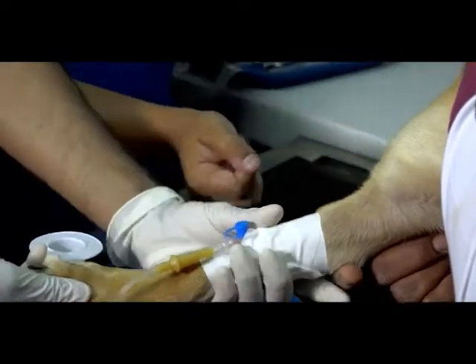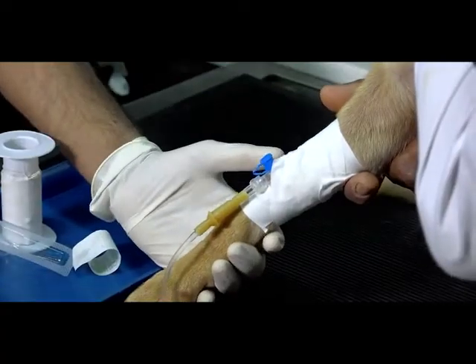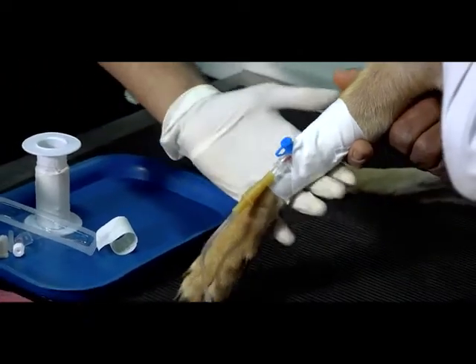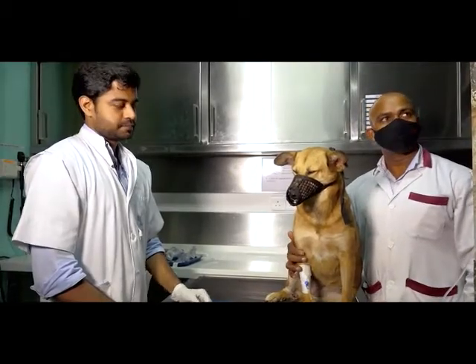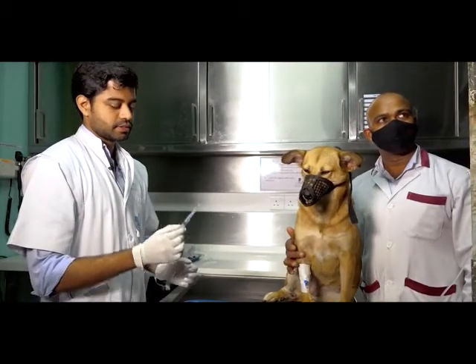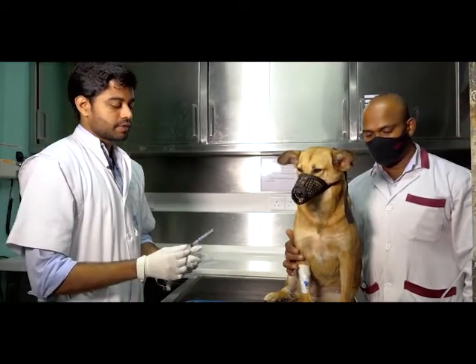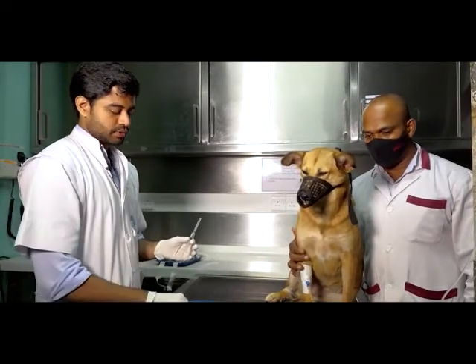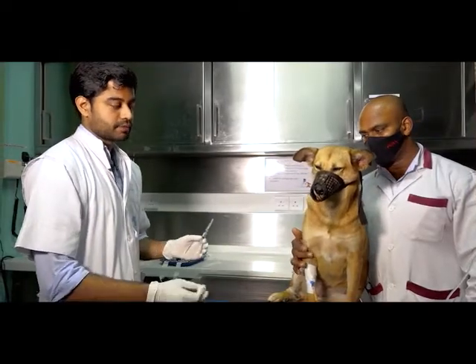So we've placed the IV catheter to Harmina, and you can give whatever drugs you want, IV drugs. Harmina is ready for her treatments. Well, we're going to administer drugs intravenously, and for that we will need the drug and also a swab that is soaked with surgical spirit or 70% alcohol.